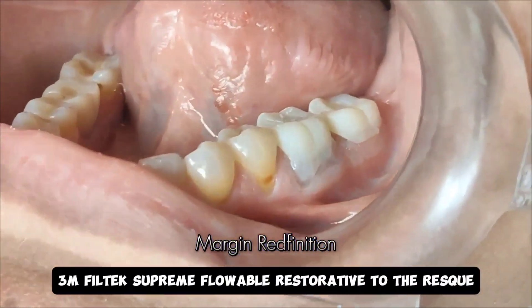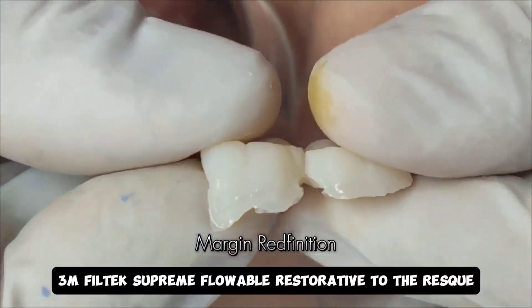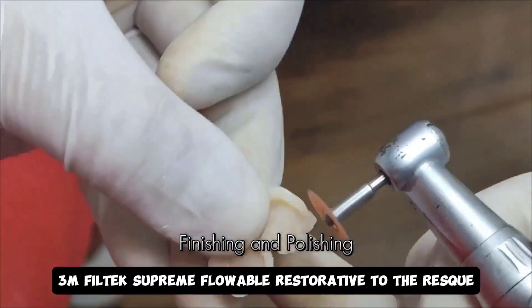What I have done here is I have used 3M Filtek Supreme Flow to add to the area where the resin — which was Pro Temp 4 — was deficient. What you now see is me going through the regular protocol for finishing and polishing of these provisionals.